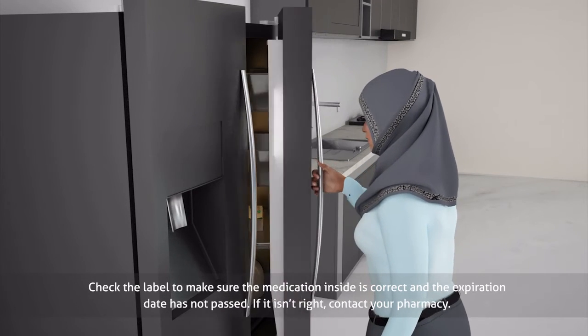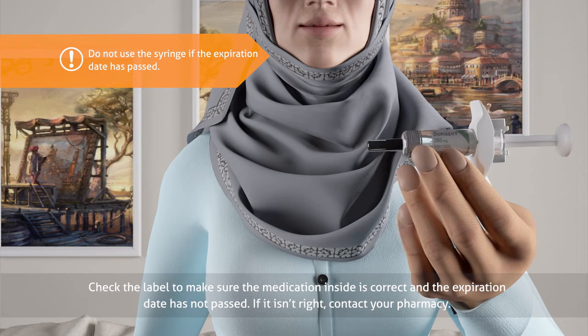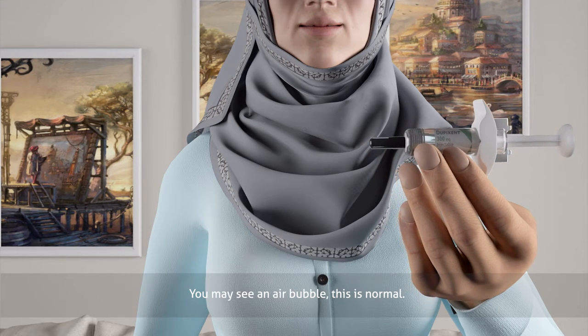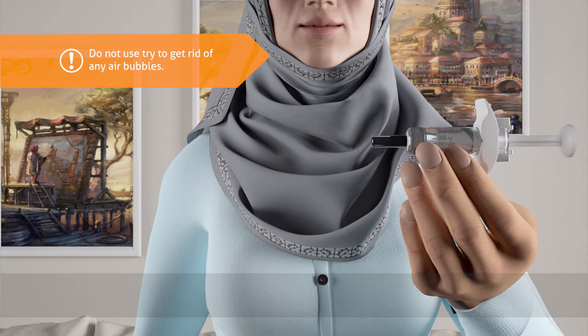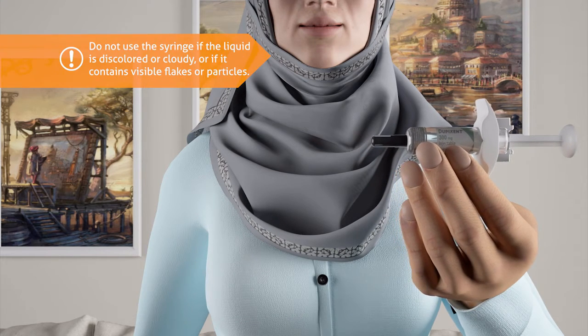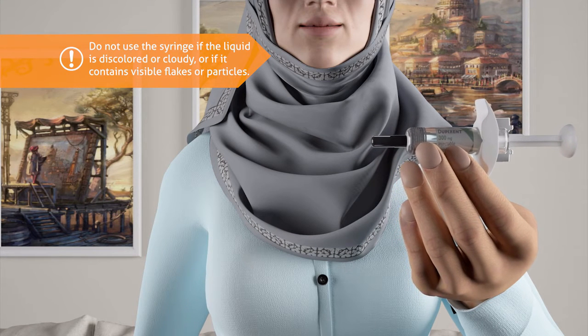Check the label to make sure the medication inside is correct and the expiration date has not passed. If it isn't right, contact your pharmacy. You may see an air bubble — this is normal. Do not try to get rid of any air bubbles. The liquid inside should be clear and colorless to pale yellow. Do not use the syringe if the liquid is discolored or cloudy or if it contains visible flakes or particles.